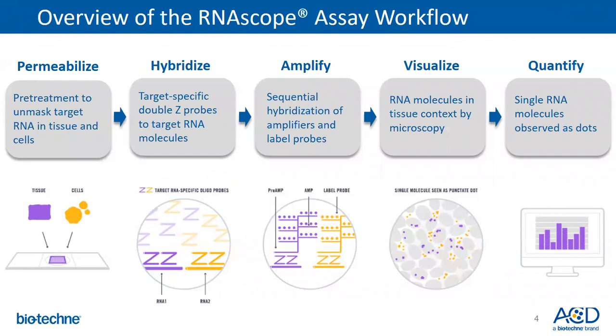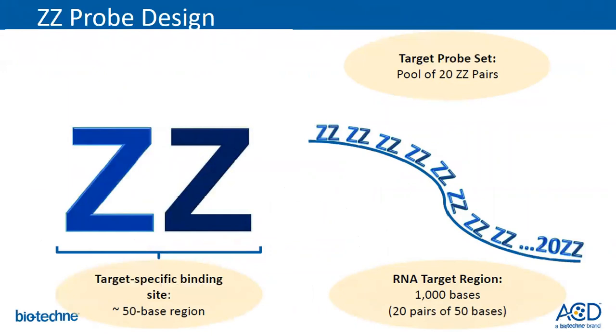Do you have to have the RNAs in the cytoplasm, or can you also visualize it while it's being transcribed? Good question. No, it's designed to pick up cytoplasmic RNA. Now, there's nothing to stop our probes from binding to the target transcript wherever it may be. So if it is a nuclear transcript, for instance, like a pre-microRNA, or if you have an AAV that you're using, you could in fact see RNAscope signal in the nucleus as well. Typically we don't like to because we worry about picking up DNA. So if you're looking at an mRNA transcript, most likely it's going to be cytoplasmic.